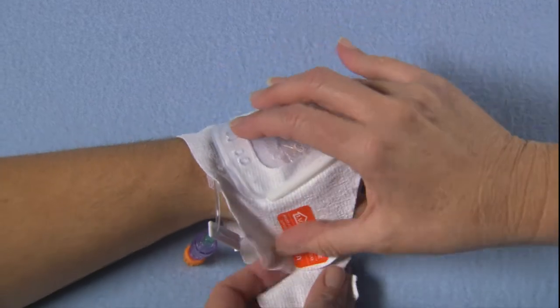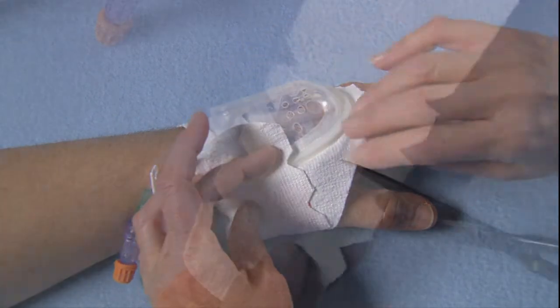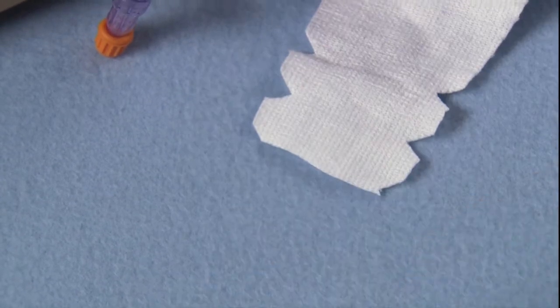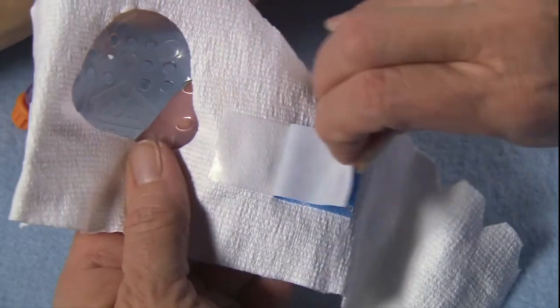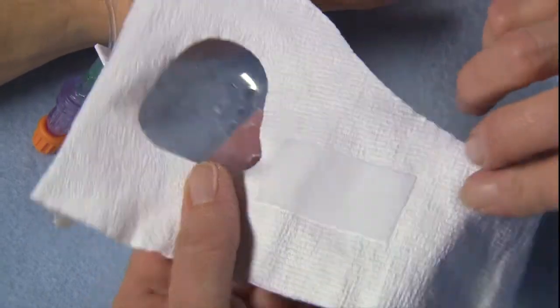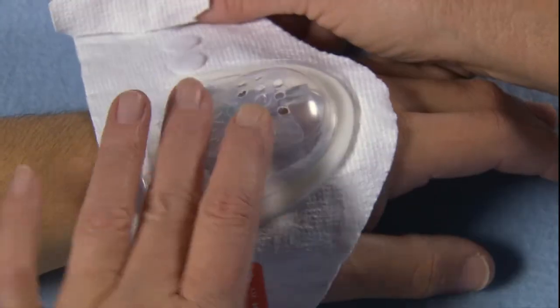Wrap comfortably, leaving enough stretch to fit a finger under the fabric. Cut off excess fabric. Remove the blue release paper to expose a strip of soft surgical tape that keeps the device from sliding. Rewrap fabric, gently pressing the tape into place.